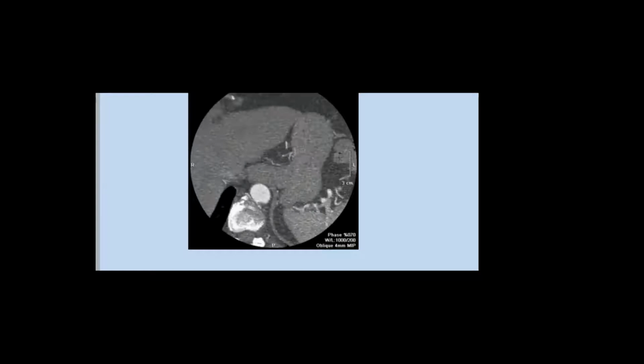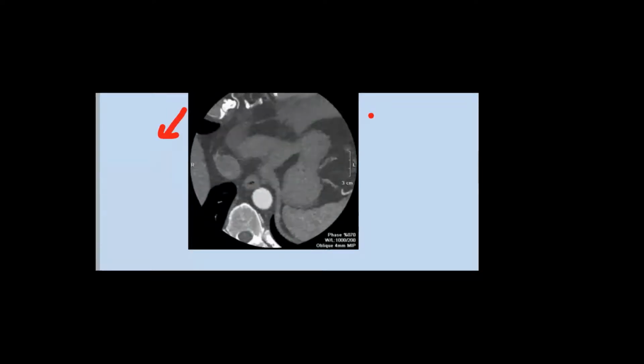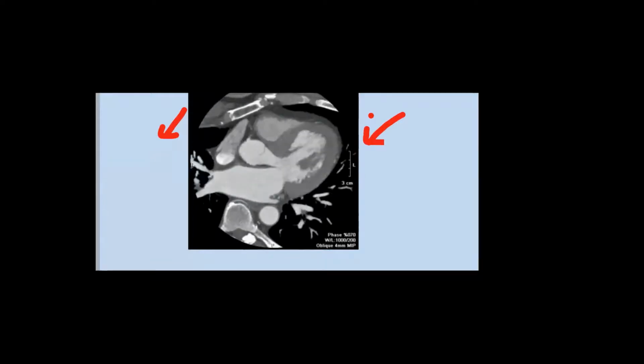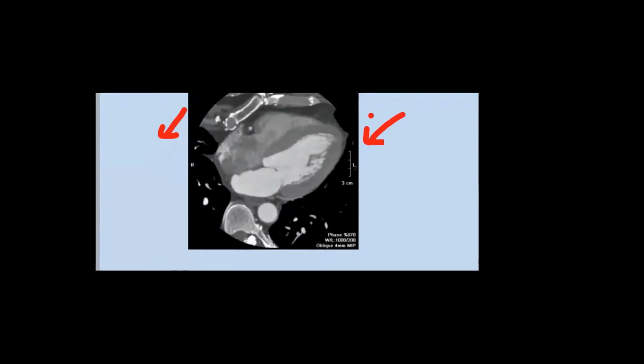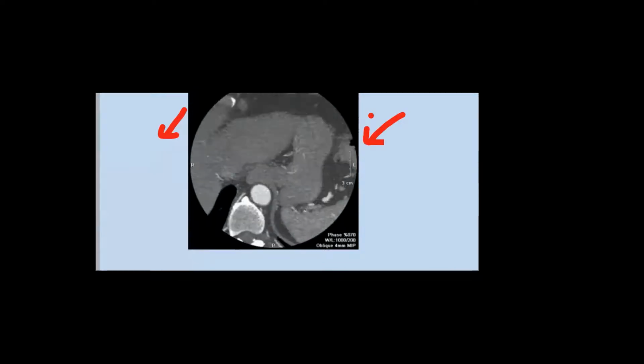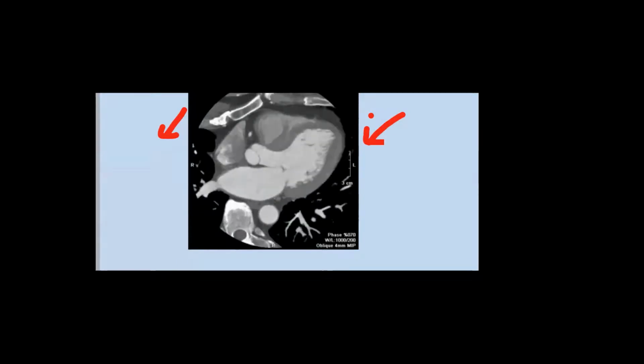Just a moment. Yes. This is the right, and this is the left. Okay? And we are going into the heart craniocaudal, so from top down, okay? And from anterior to posterior.